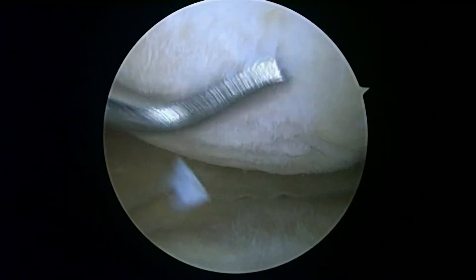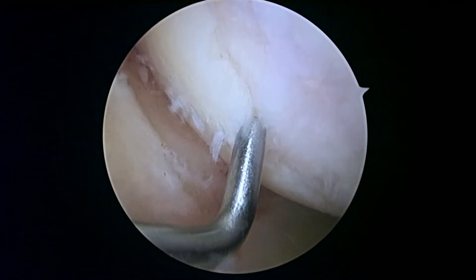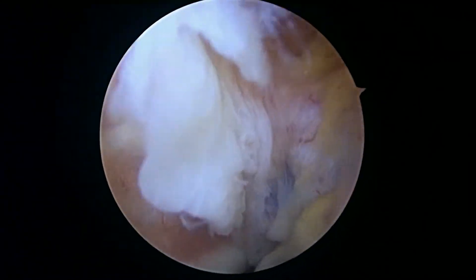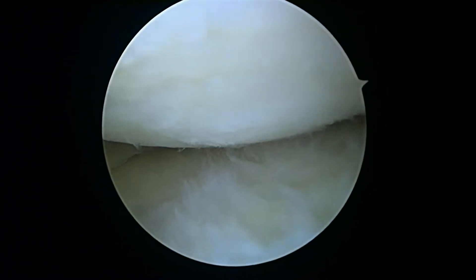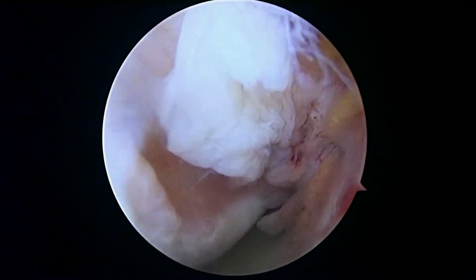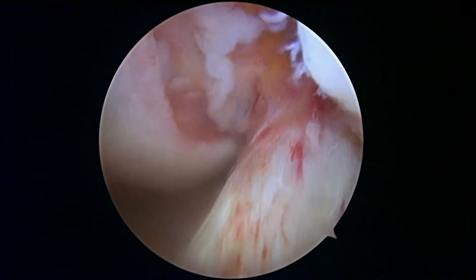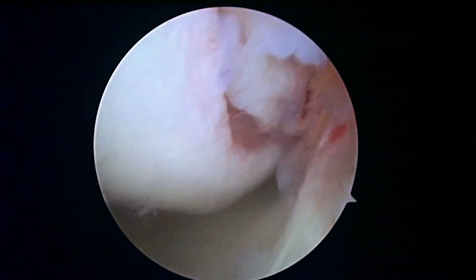I do think your symptoms are coming from all this stuff — that's really the issue, and that's what we've been working on. We worked right here where there was a flap that was loose, and now it's not. As we look in the central part of the knee, here's some good news: you have a really nice-looking anterior cruciate ligament. There it is right there — that looks great. No signs of any problems there, so I'm happy with that.